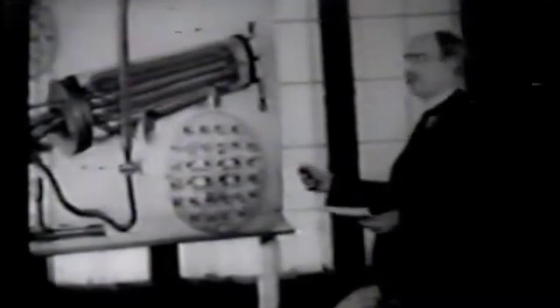Please note that this apparatus is attached to a living animal, so that we have here a part of his blood circulating outside of the body, circulating in this apparatus in such a manner that it can give off the diffusible constituents to the fluid outside of the tubes. In order to allow the blood to circulate in this way, outside of the animal body, we must mix something with it that will prevent the blood from coagulating in these tubes.